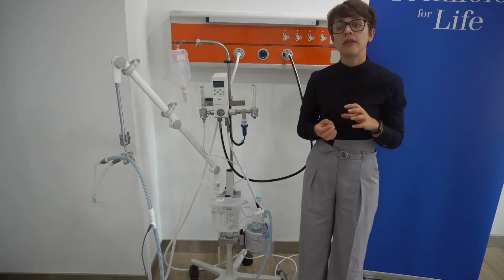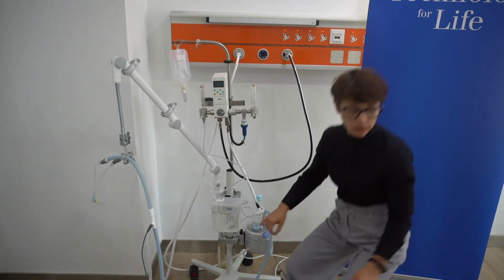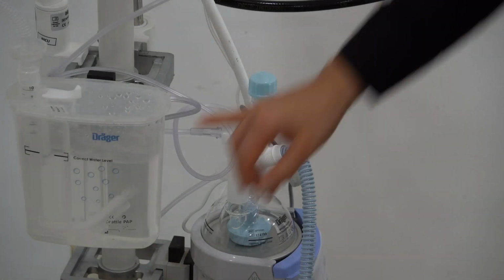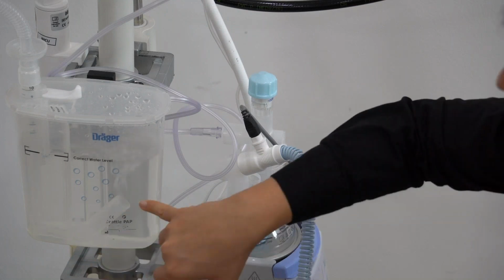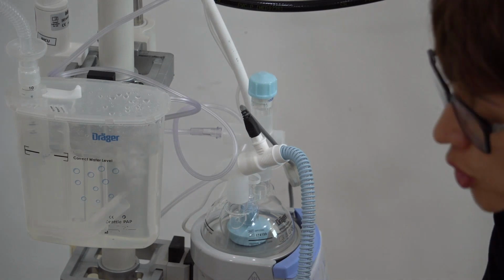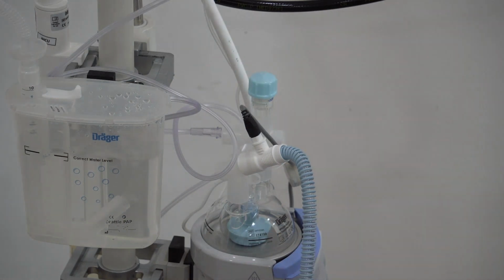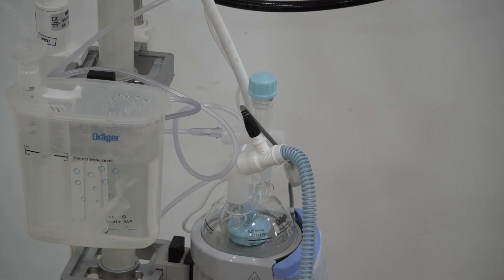According to this research, let me demonstrate that to you, the 135-degree angle returns a better oscillation. So basically, Bubble CPAP generates this water oscillation and thus generates certain volumes.